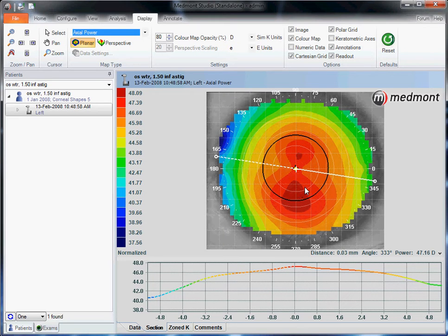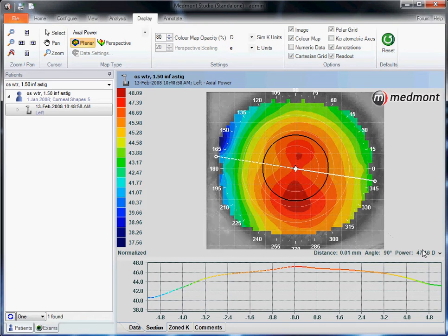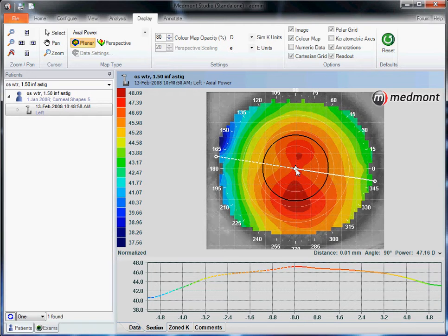Axial is to understand the power of the eye. We can click our cursor anywhere on this map to understand the power at that particular point. If we were to change the apical corneal power from 47 diopters, this refraction would change by an equal amount — if we change the apical power by one diopter, we change the refraction by one diopter. Axial is for power: is it with the rule, against the rule, irregular, or regular corneal astigmatism?